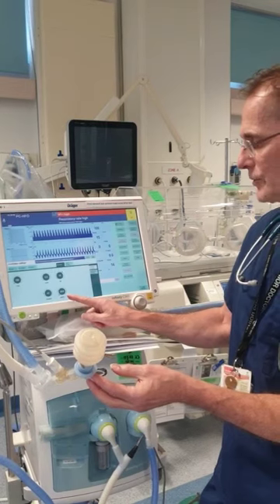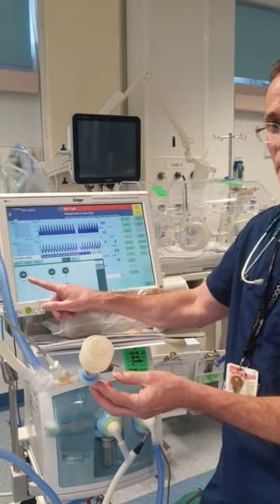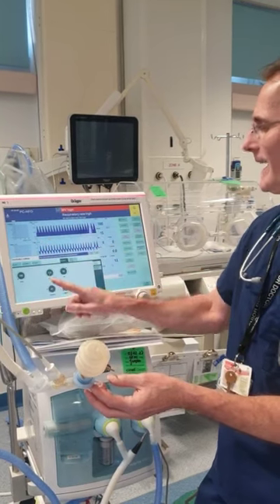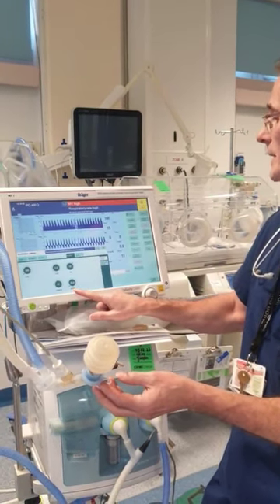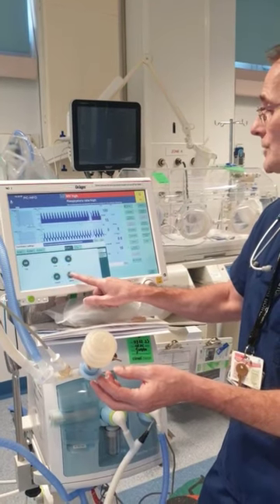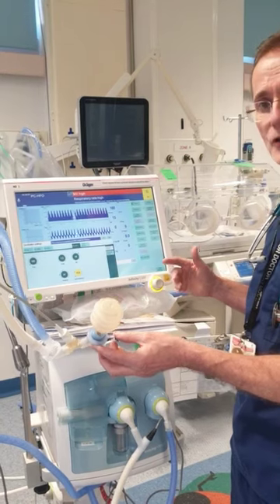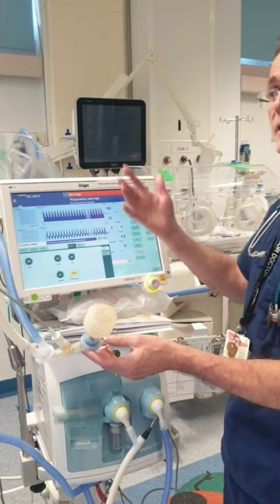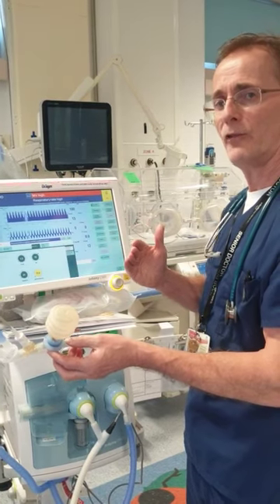after we switch to it, we want to consider the FiO2 that's required, consider the baby's saturations, and then incrementally, typically, we will increase the mean airway pressure of oscillation by 1 or 2 centimeters, waiting every 5 minutes or so to see a response in the saturation of the baby. And that is a way of opening up the lungs.